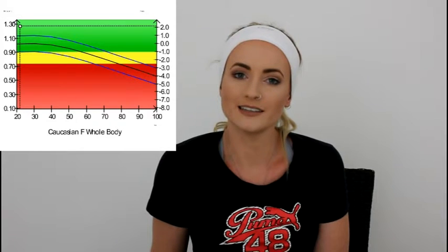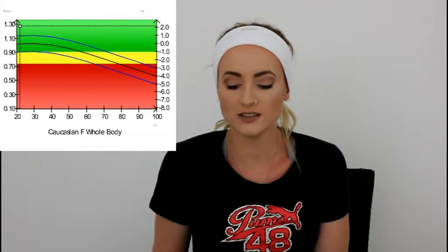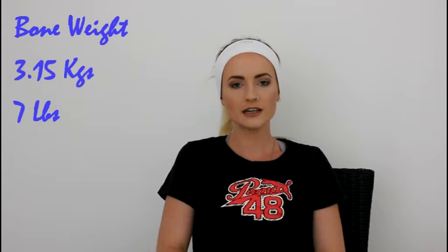There are 3 lines. The middle line is about average, it's healthy. The top line is excellent, really good, and mine's all the way up near 1.3, so I'm indestructible pretty much. But the only thing is that puts a lot of weight on my body. My total bone density is nearly 6% of my body weight. So I'm big boned, you could say.